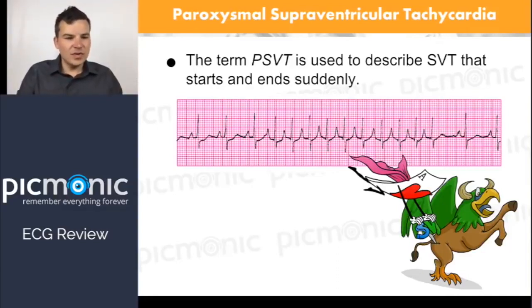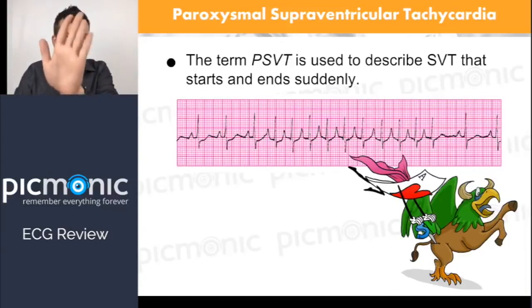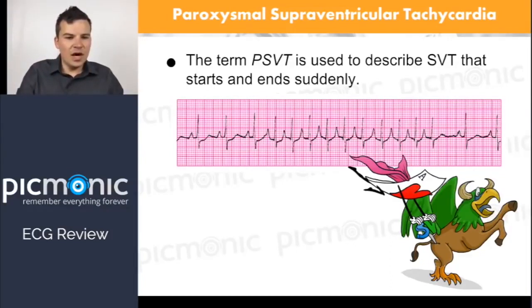So look at this rhythm here. This rhythm's chugging along great. If you took your hand and covered up this section, from here back, and looked at just this rhythm and imagine you did that same thing for 6 seconds, everything's great. I mean, it's a great rhythm. So, that's normal. But what happens is when we look at the steps, what's the rate here? So Jack's an overachiever and apparently already counted 15 across here. So I'm just going to believe you. So that rate right now and during this 6 seconds was about 150 beats a minute.